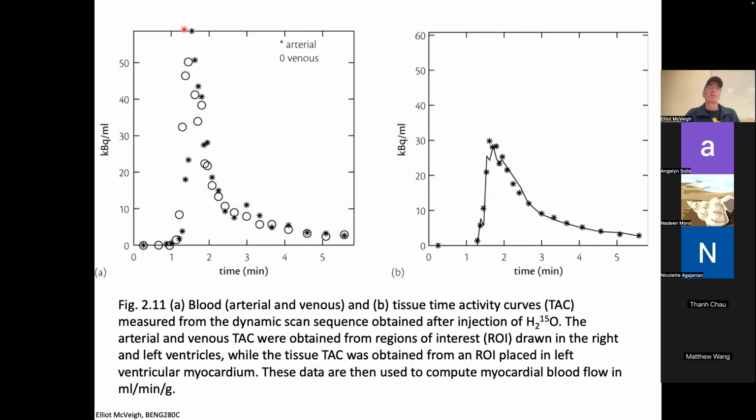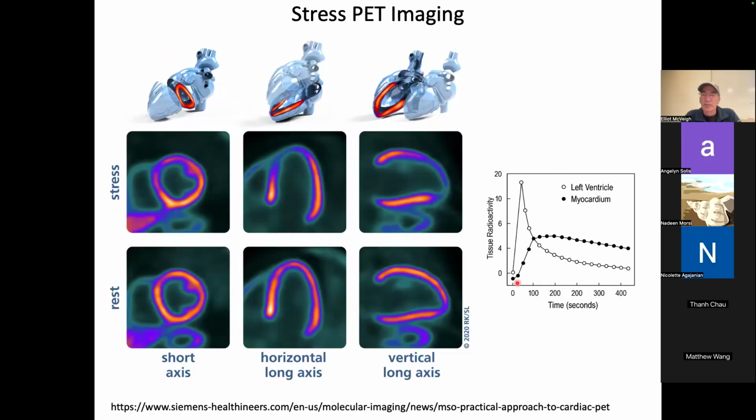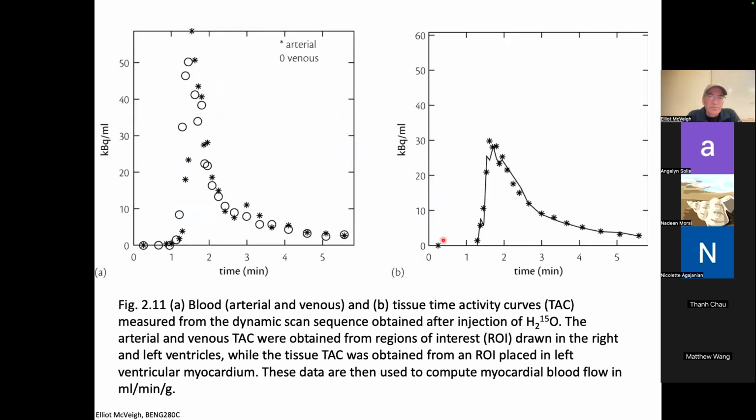Obviously, if it was up for one time frame and then back down to 0, this would not get very high. It wouldn't get this high, but it would come up at whatever the native absorption rate of that thing is, and then it would decay away. It wouldn't be governed at all by this, right? If we go back to this curve, you look, this is 3 minutes here. It's down at 4. I don't know how. 3 minutes. That's about the same, right?